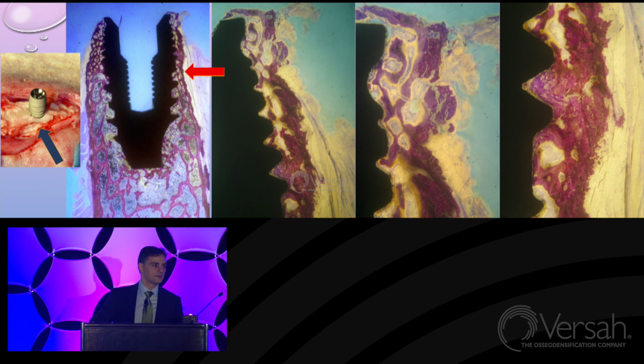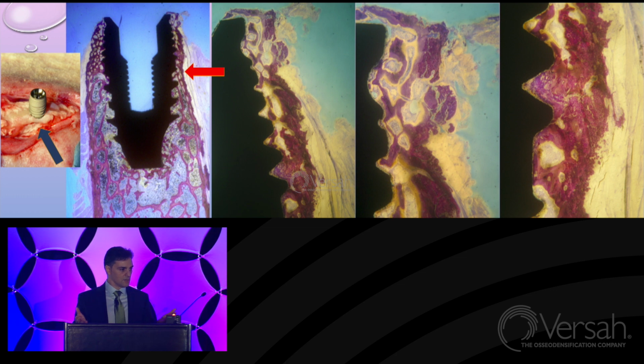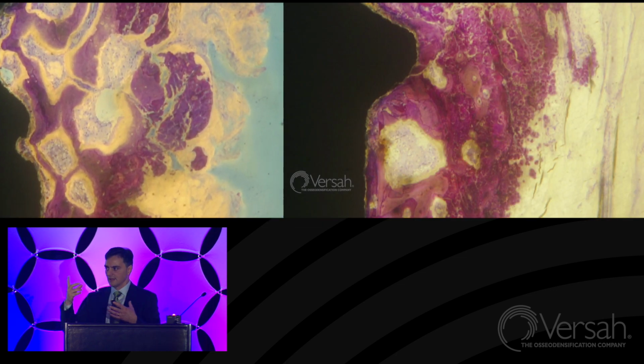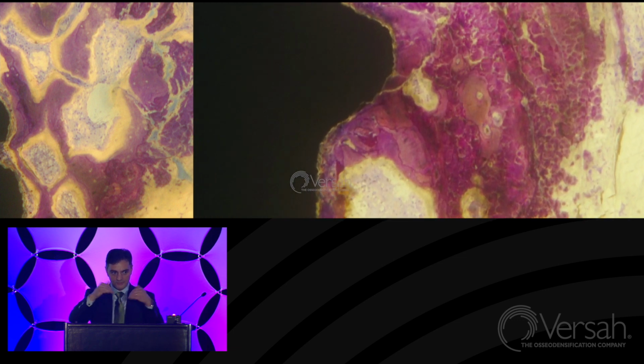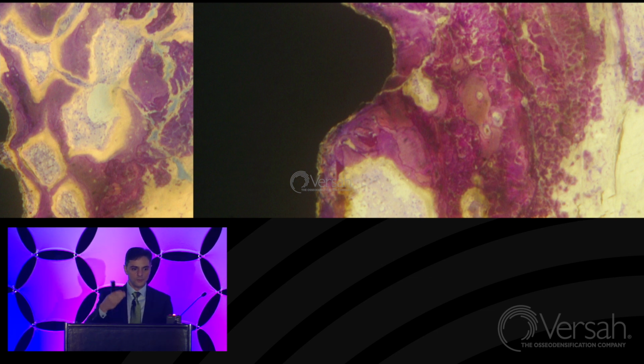This is not present in the normal biology. It's something produced by the process of condensation, expansion and grafting. This process is activating a huge amount of new bone formation. What you see here, this yellow line, are all osteoids, new bone formation. And at 2 months, this large amount of osteoids is not usually seen. Usually at 2 months it is standard remodeling. We are still in a heavy formation process.